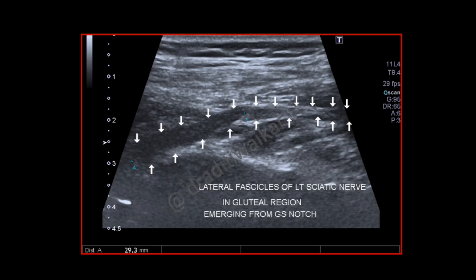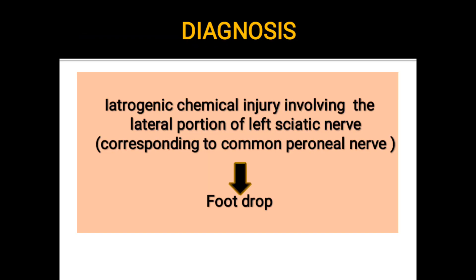This is the longitudinal image along the long axis of the left sciatic nerve. We can see there is diffuse reduced echogenicity involving the lateral fascicle bundles of the left sciatic nerve in the gluteal region as it emerges from the greater sciatic notch.